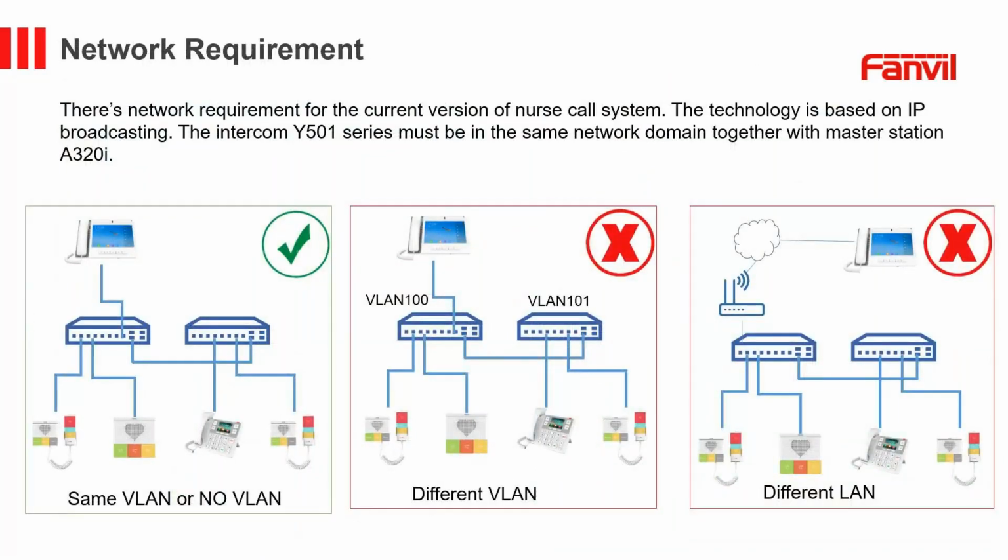For the system to function correctly, all devices including the Y501 series intercom and the A320i master station must be on the same network, so not different VLANs and not different LANs, to ensure smooth communication between devices and prevent any network issues between your devices.